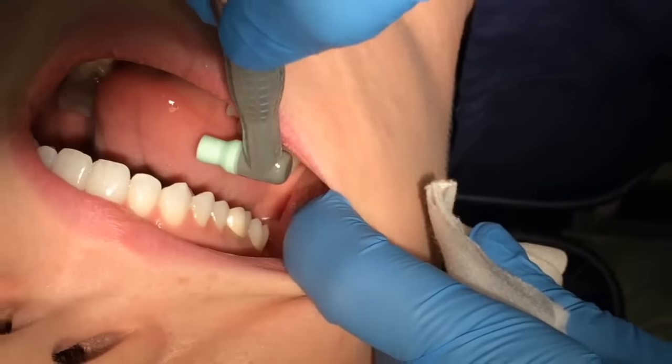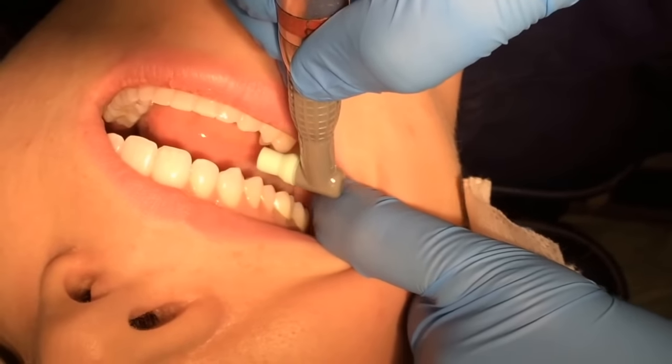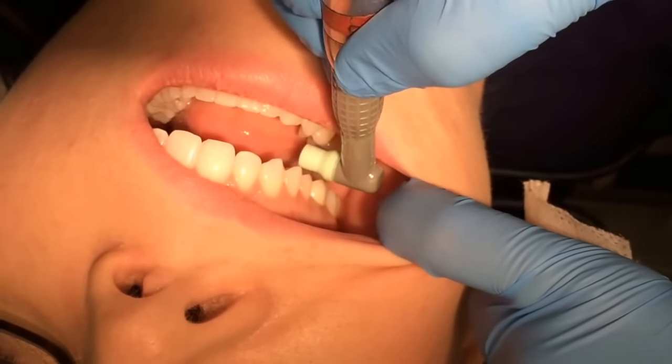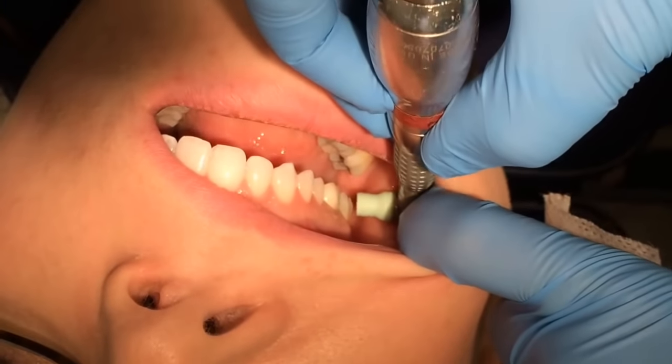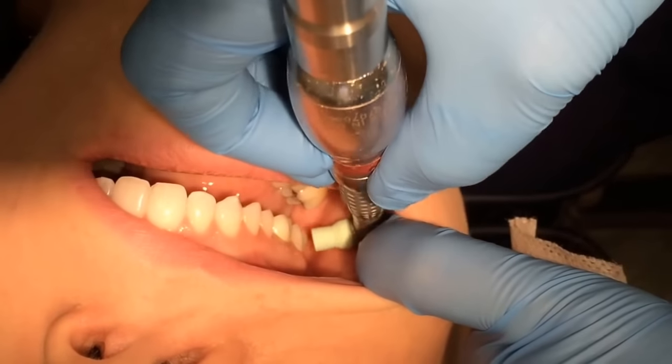I have my patient close a little bit — turn a little bit away from me and close just a little bit — so I can get more extension on retracting their cheek and have them still be comfortable. I make sure I come across the gingival margin and then clean the tooth.